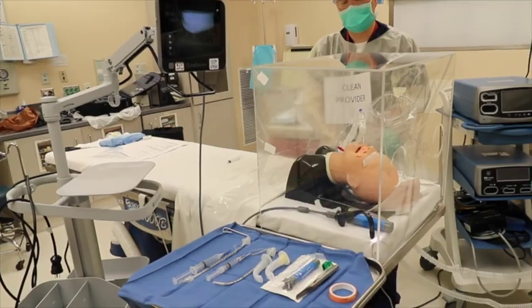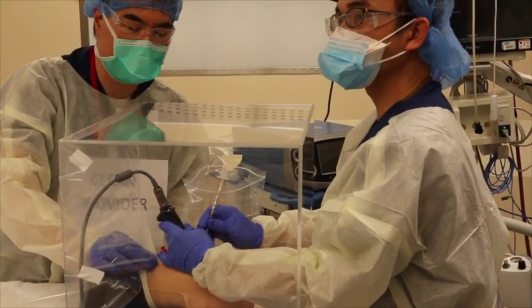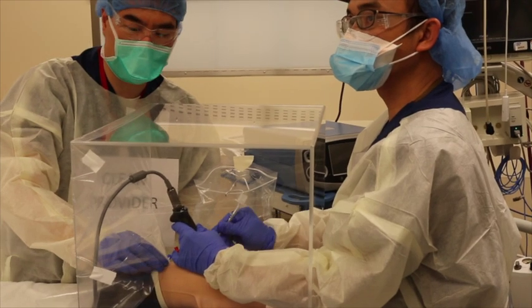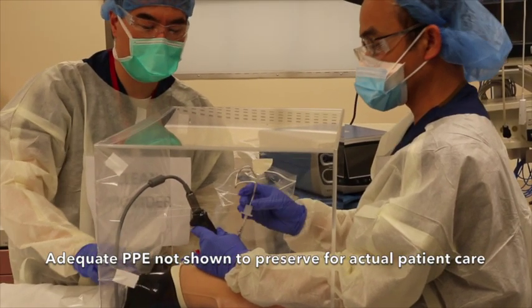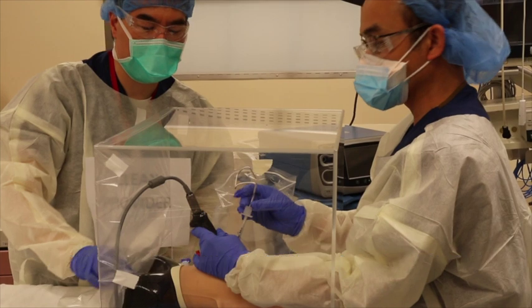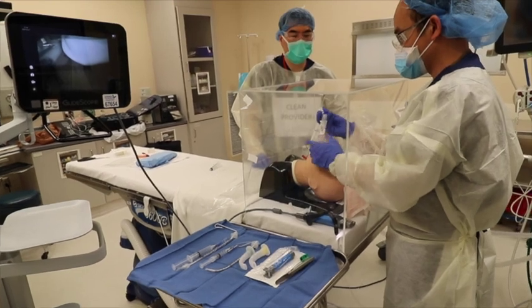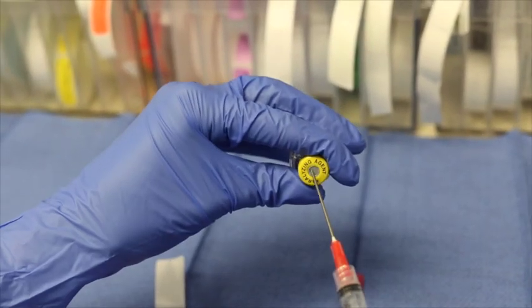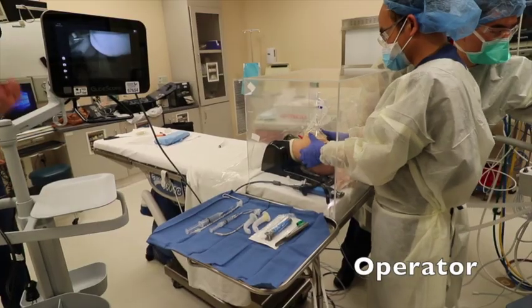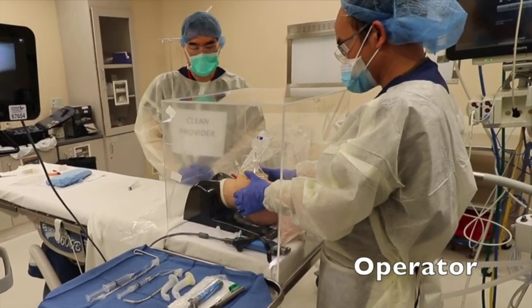The anesthesiologists at Children's Hospital Los Angeles have made some small modifications to better suit their patients. All operating room staff should be dressed with the appropriate personal protective equipment. The core anesthesia team will have a minimum of one clean provider assisting — such as adjusting gas flows and administering medications — and the operator performing laryngoscopy, who shall be designated contaminated.